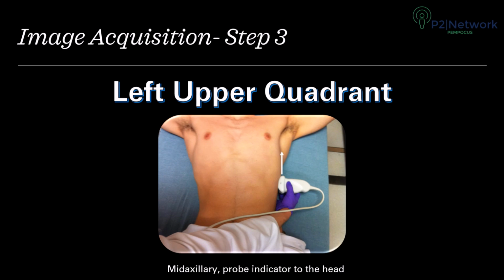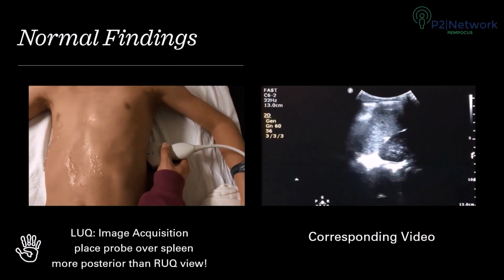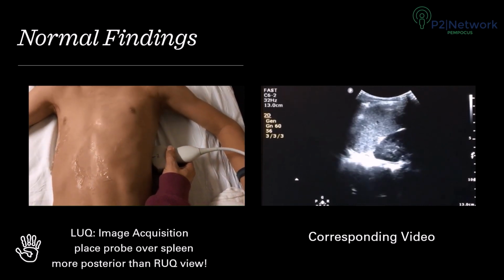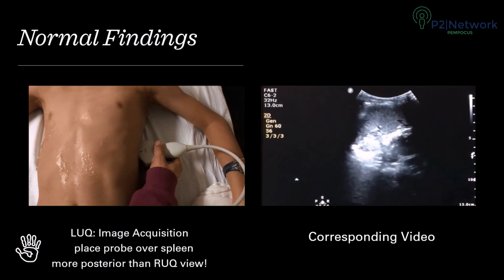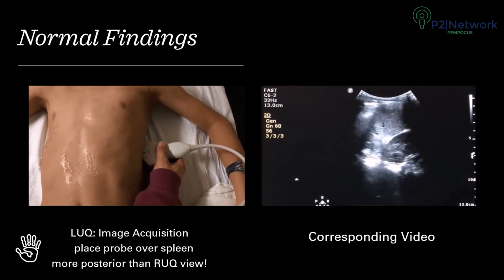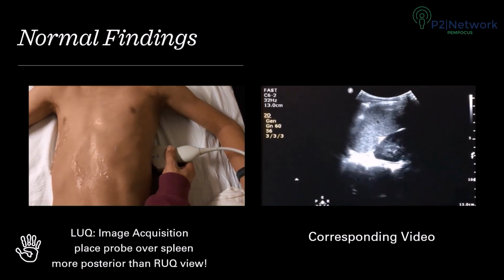For the left upper quadrant view, have the probe marker pointing towards the patient's head. And you want to be just posterior to the mid-axillary line, slightly more towards the head and slightly more posterior than you are on the right upper quadrant view.